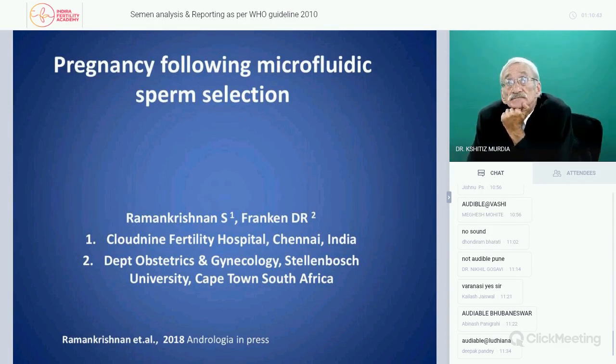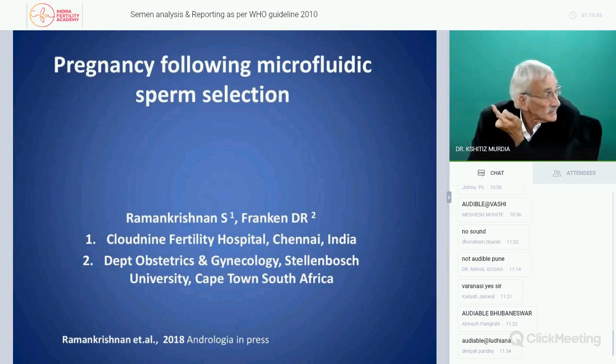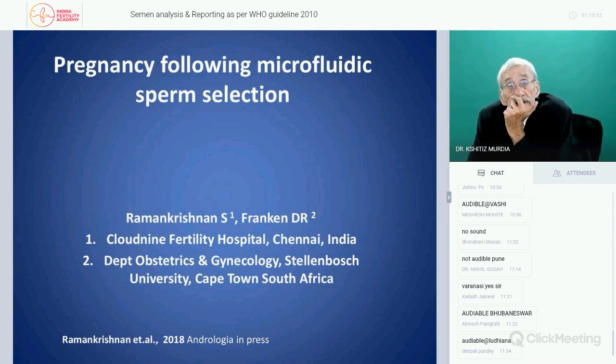Now, this is the microfluidic, a new method of selecting sperm that's supposed to be DNA intact or non-fragmented sperm. Study done by Dr. Sujata in Chennai, India. This is an interesting study.